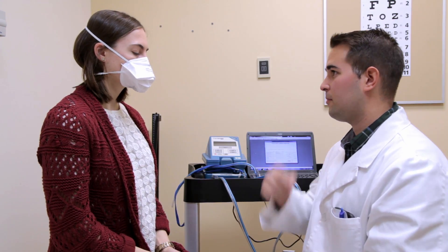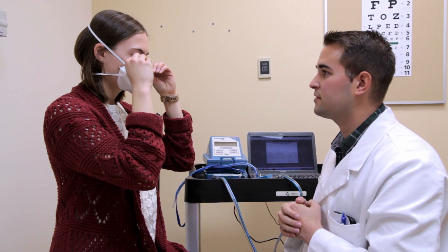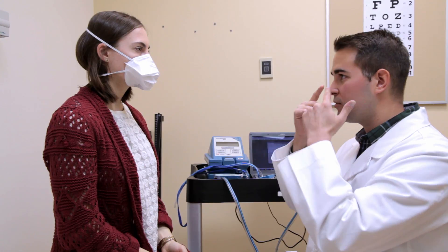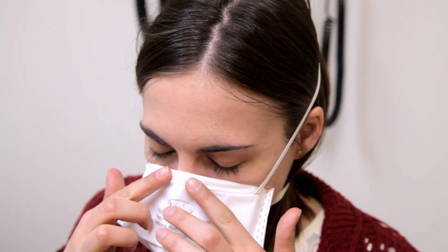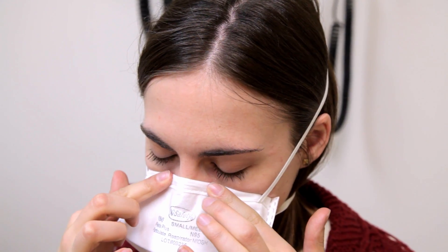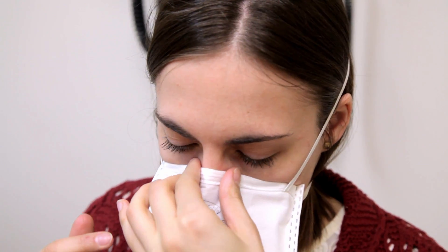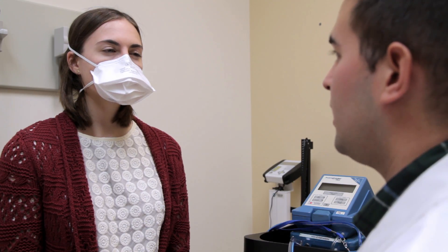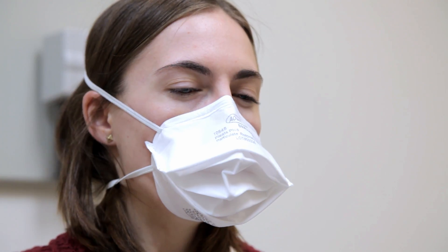Many industrial companies and healthcare professionals have come to depend on Intrinsic Analytics for properly fitting their employees and students with respirators. Intrinsic Analytics uses the PortaCount Plus respirator fit tester with the N95 companion system for quantitative mask fitting. We take real-time particle measurements both inside and outside of the mask while the user is wearing it and performs a series of exercises that are designed to mimic similar movements made in a real work environment.